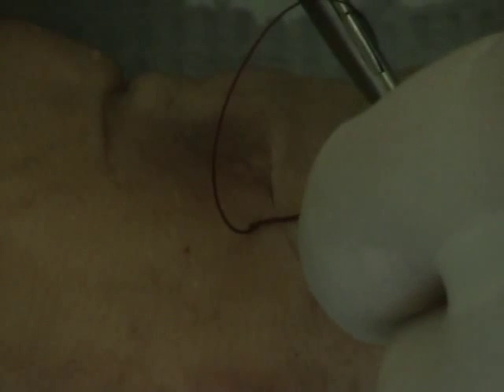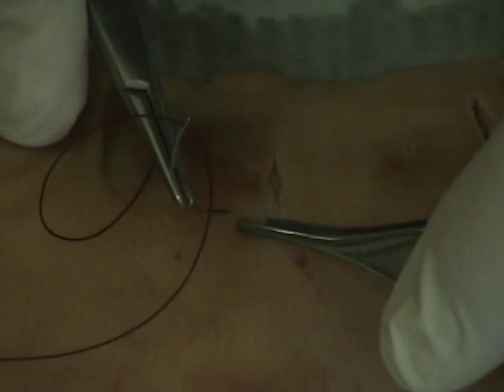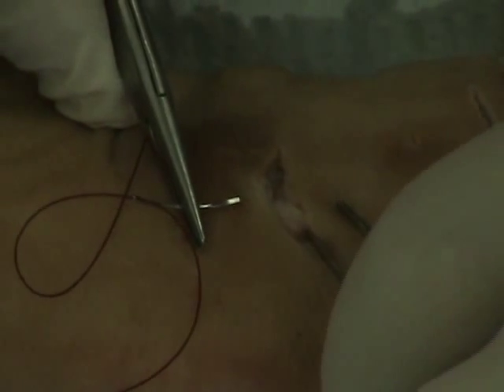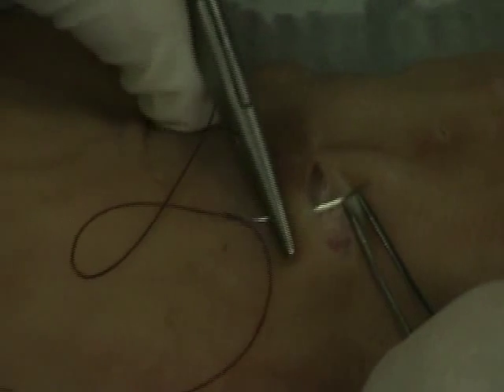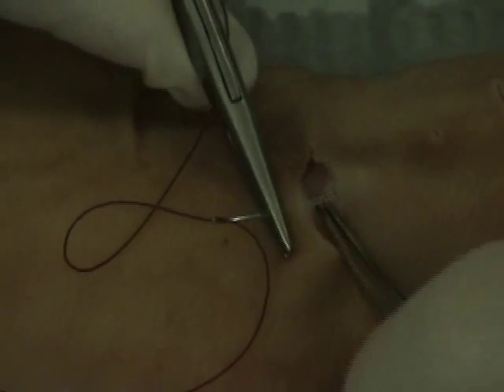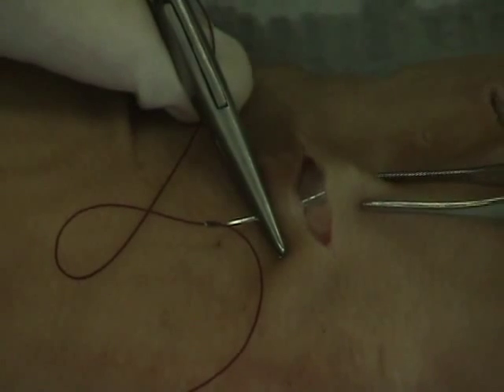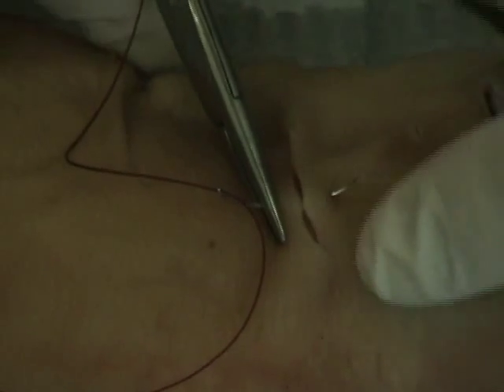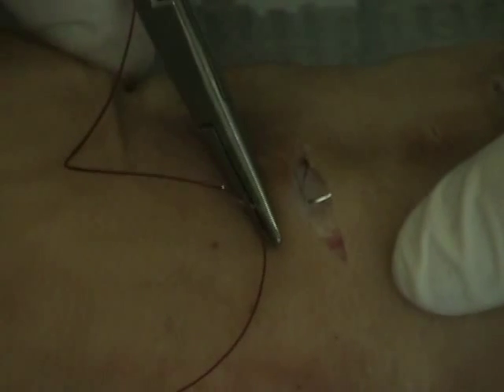Or what I could do is just take that stitch out completely and change my position again. So let's go ahead and pull the stitch out. Let's change my position just slightly, and we'll see what we can do with that. So I'm going to come a little bit more here, pop through the side over here. Okay, going to basically go over just a snitch, pop through, and just by looking at this now I can see that I'm going to have a dog ear here. So let's back this up, move this over a little bit more this direction.